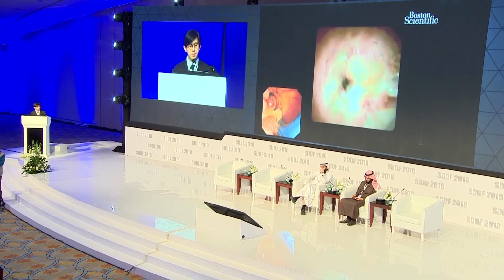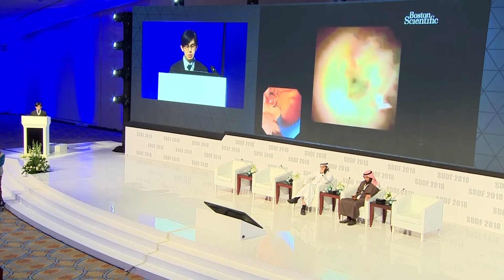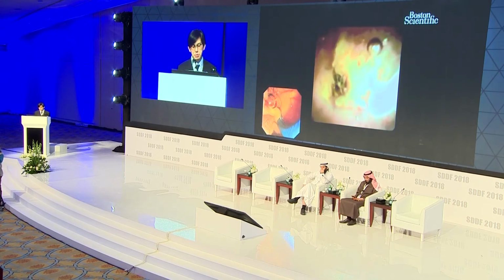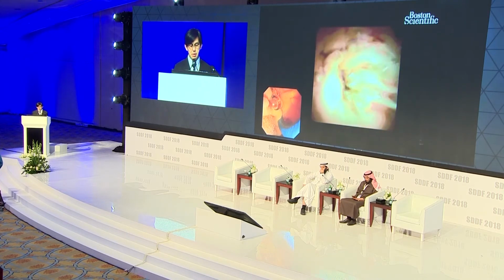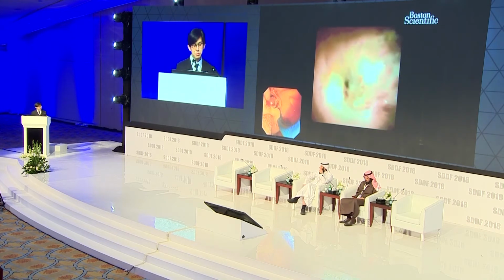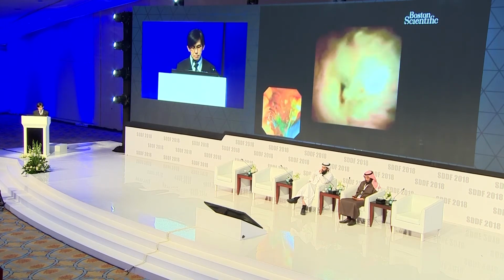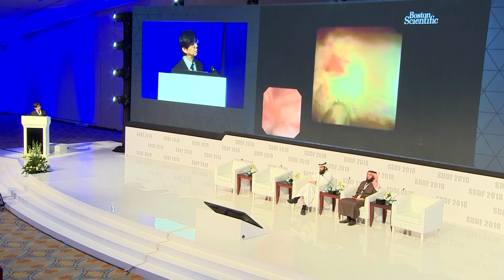We went on to biopsy this patient, and the biopsy showed a lot of abnormal lymphocytes consistent with disseminated lymphoma disease. She went on to receive chemotherapy, and in this particular case the patient also avoided a Whipple's procedure. And as I said earlier, you also see vessels that are slightly dilated. So it's really quite difficult to differentiate sometimes, particularly after a period of stenting.